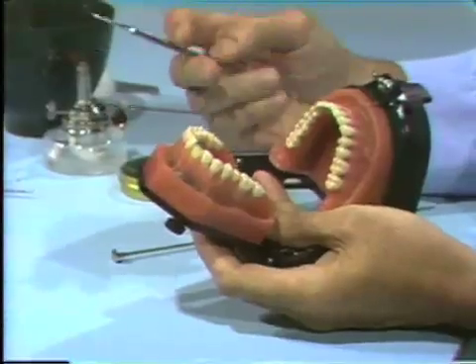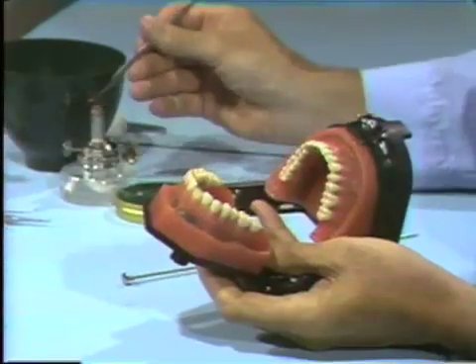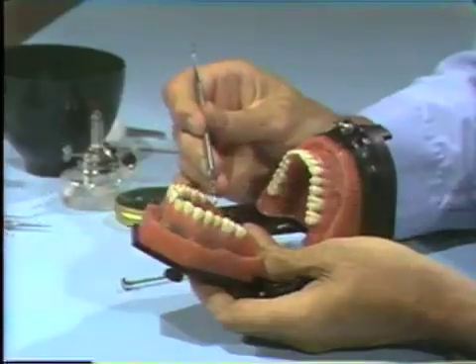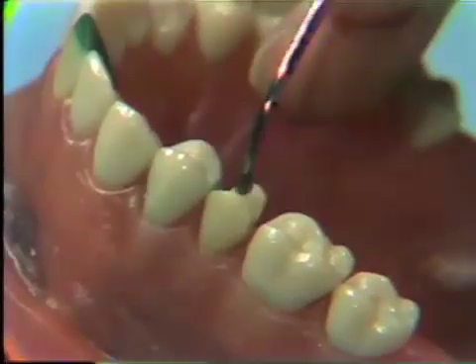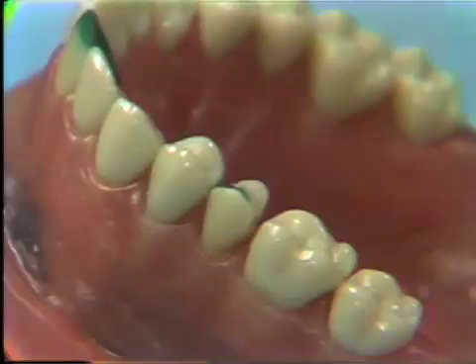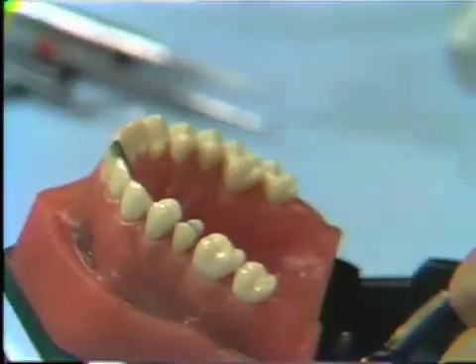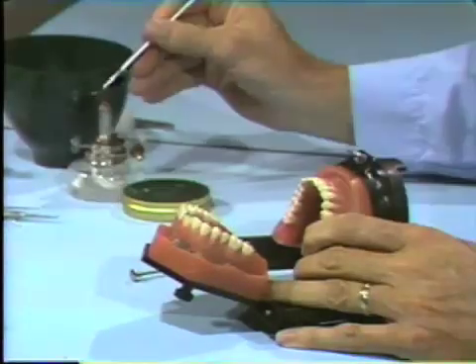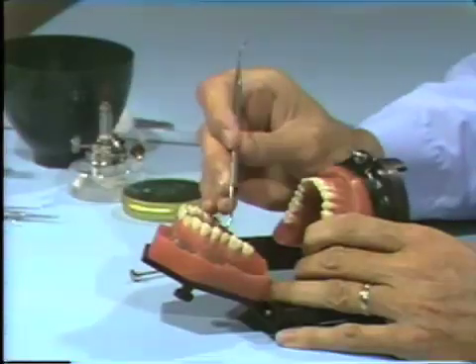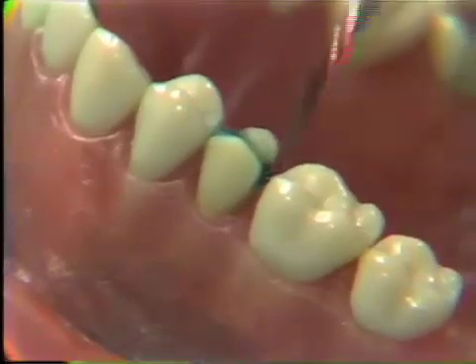You can use whichever instrument you work best with. I'm going to use the P.K. Thomas waxing instrument number one. The first thing I'll do is put some wax into the prepared cavity. I'll set the typodont down so it's stable. Remember to support your fingers — when working in the mouth, use the teeth to support your hands. Form a fulcrum so that you have absolute control of your instrument, which becomes even more important when working on a live patient. Don't flow great excesses of wax; flow approximately the amount you need to avoid spending a lot of time carving it away.